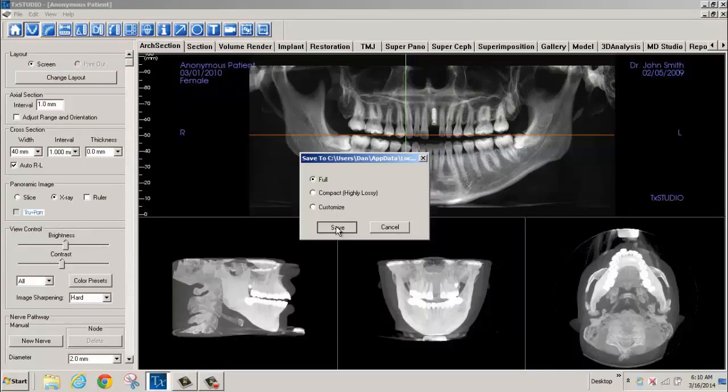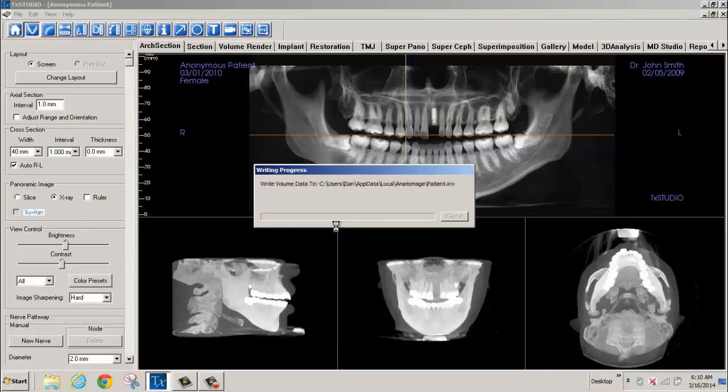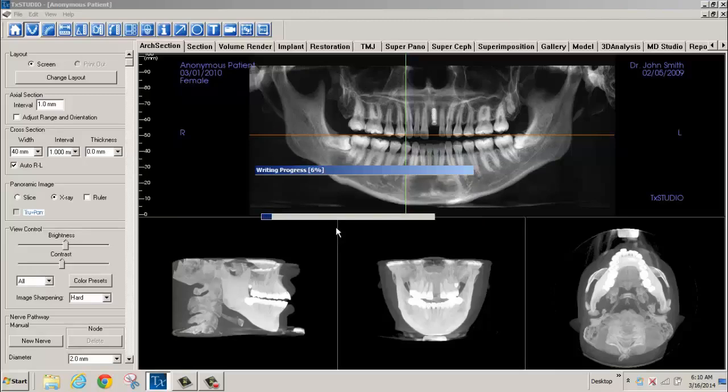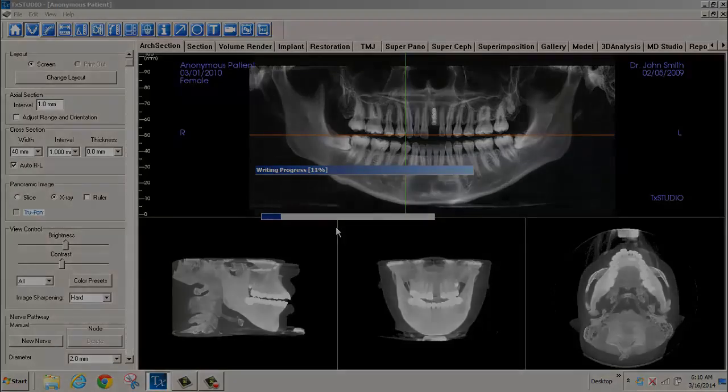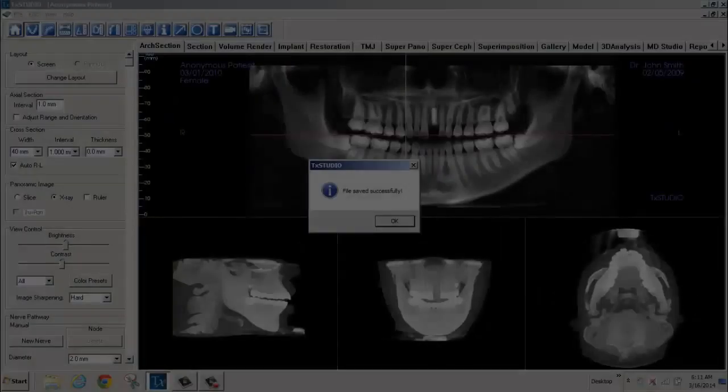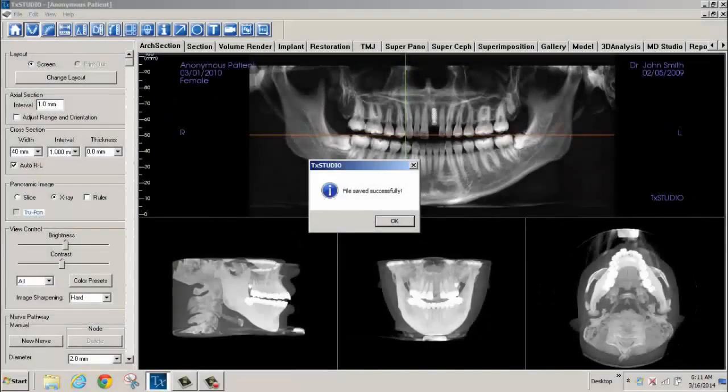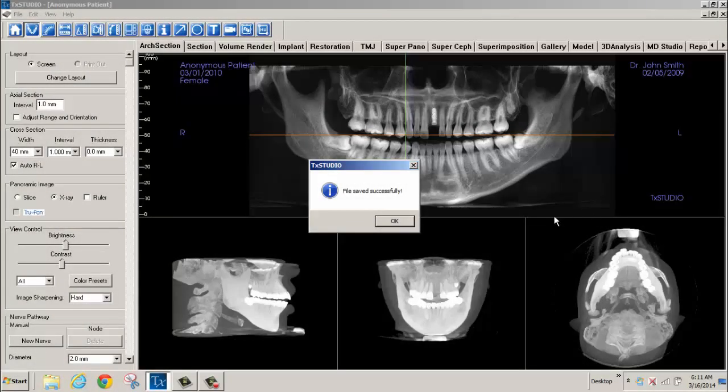Accept Full in the pop-up window and select Save. The case will now be sent to your computer's burn directory. Upon completion, select OK in the Treatment Studio pop-up window.